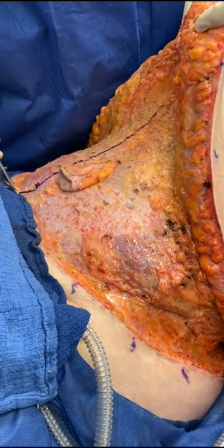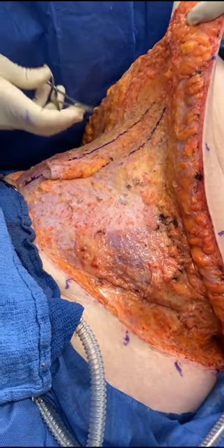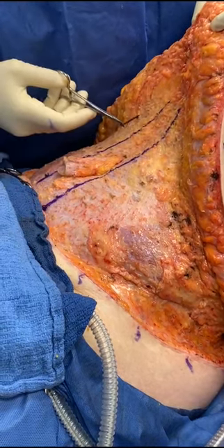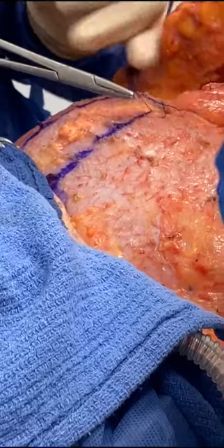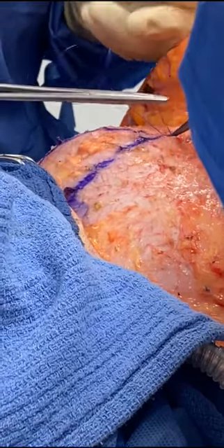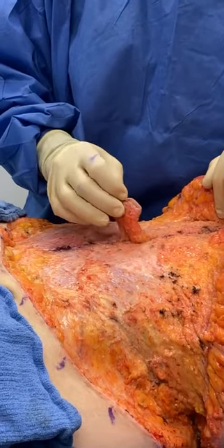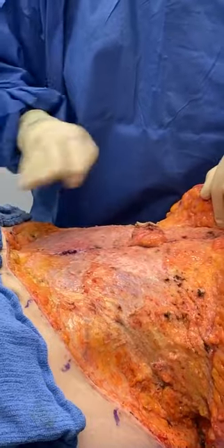Okay, so when I lift here, I can see the separation between the rectus abdominal muscles, and this is her belly button right there. So we are going to restore her anatomy and put the muscles together. She does have some intra-abdominal fat there, and we already did the top part, right, Nicholas? Right. And now we're gonna do this part right here. At the end of the day, she's gonna be flat like that. This is her belly button, and this is the rectus plication above and below the belly button. Look how tight she is now. She doesn't have that bulge anymore.